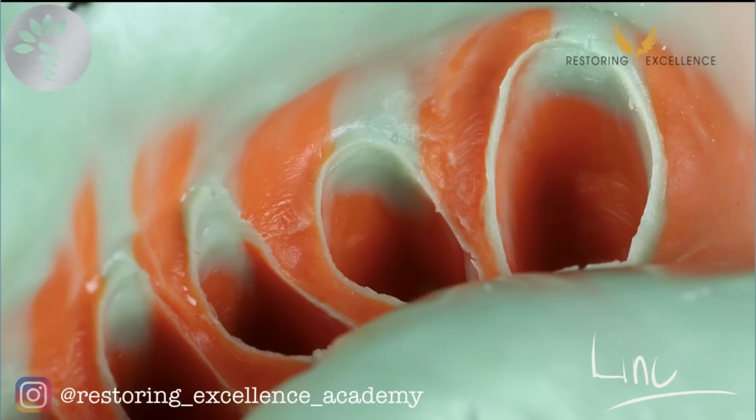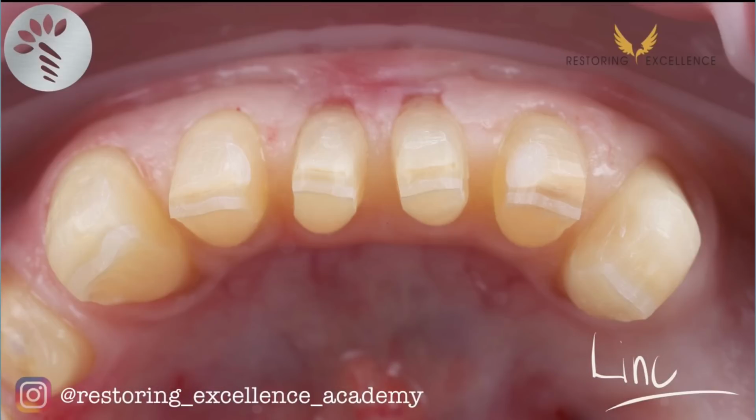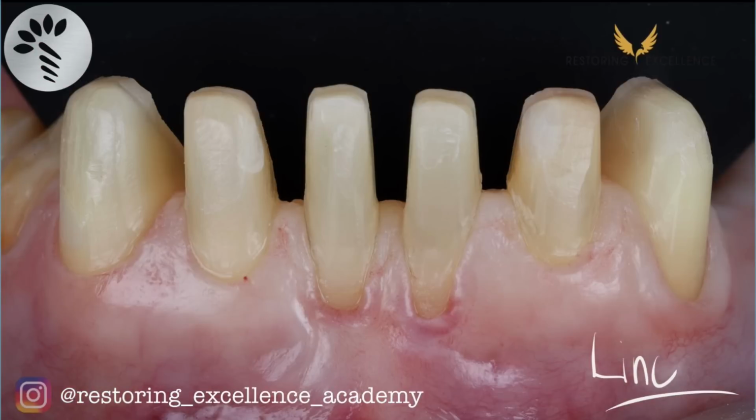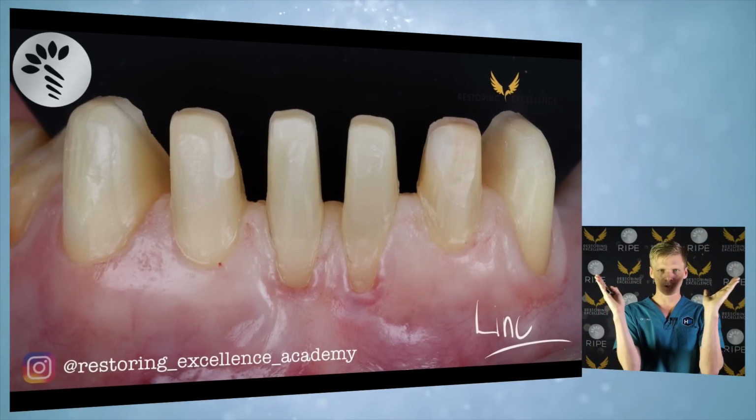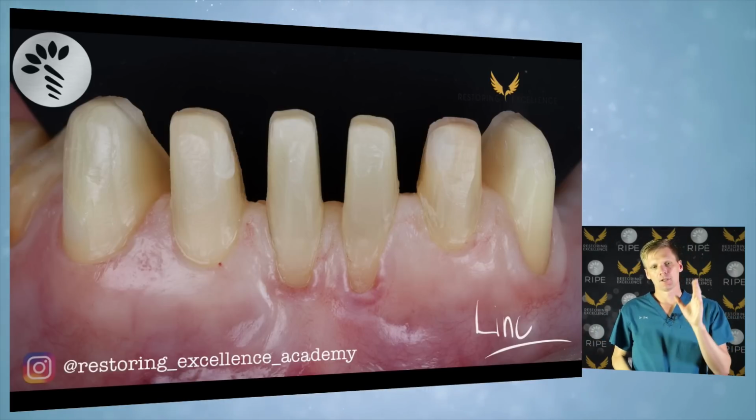So the key parts for this were, one thing I forgot to show you is the prep. If I go back a little bit, okay, maybe here. Righto, so in this picture you can see that the lateral incisor on the 3-2 is inclined distally. Now, what happens is if you have the lateral incisors too divergent, it's very difficult to get silicone to flow into those undercuts.